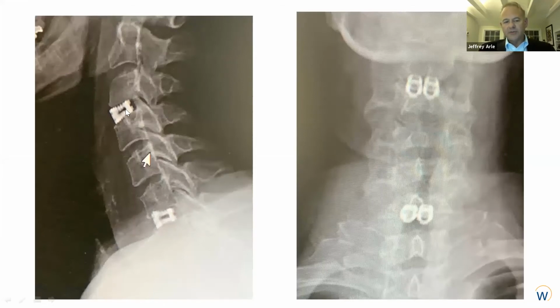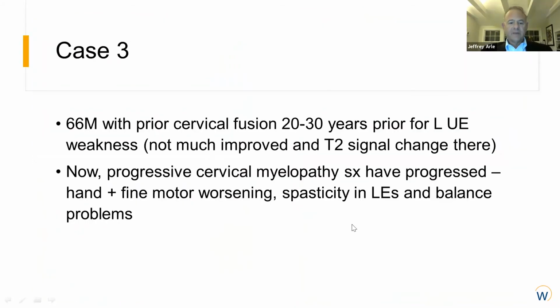Normally what would you do? You'd either use artificial discs or have two separate plates. There are a lot of sort of odd cases like this that come along. And this system is fantastic for that. Again, this patient did quite well.